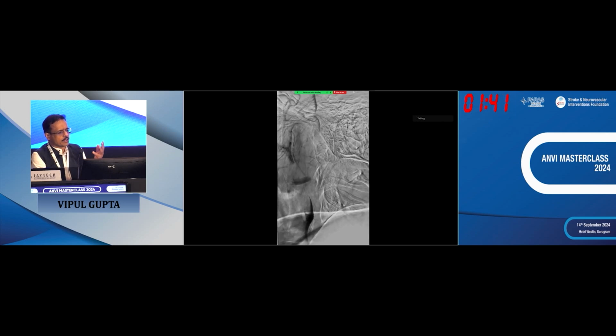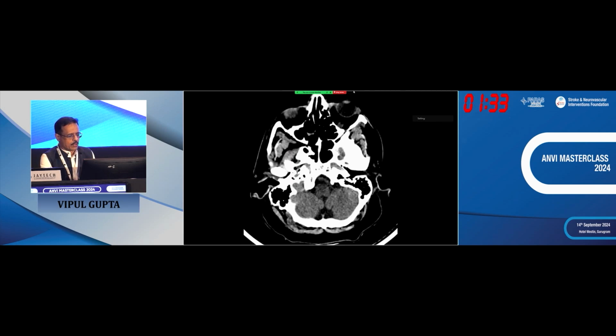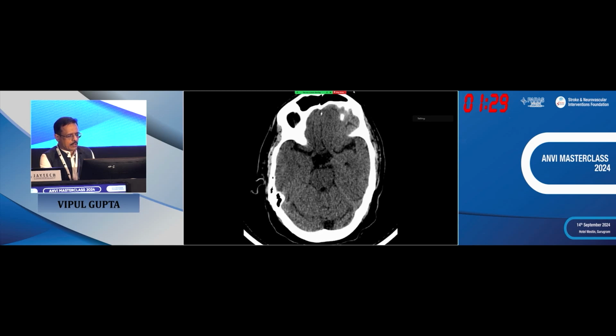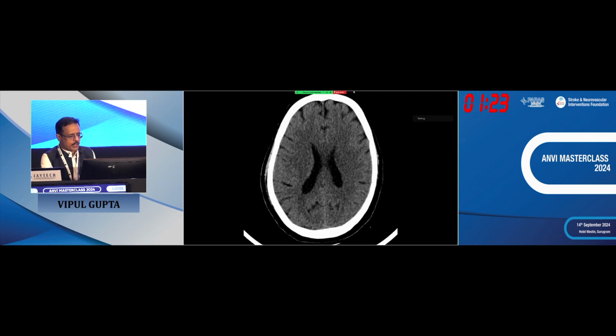As Vincent himself mentioned, in dissections, the data is clear. I'm sorry, it's coming out as negative. So all arteries were filling very well from the ACOM region. And that's the CT scan of the patient. It showed only a small infarction. He made a dramatic recovery, actually. Thankfully, it didn't take us much time.